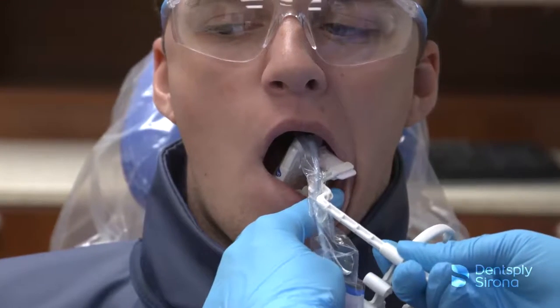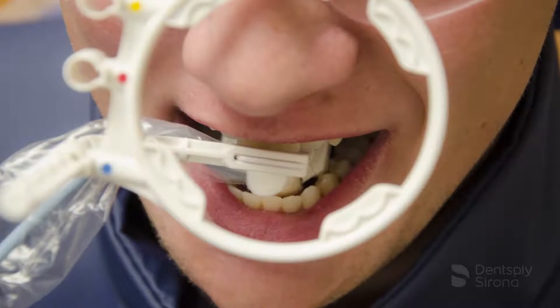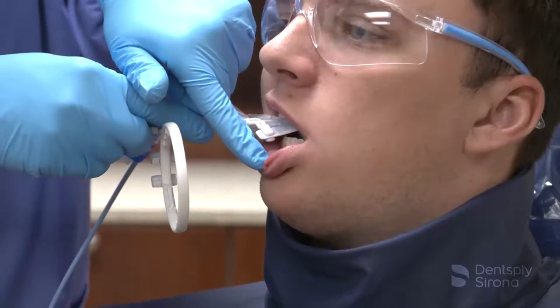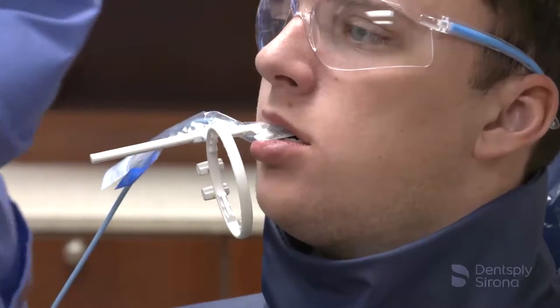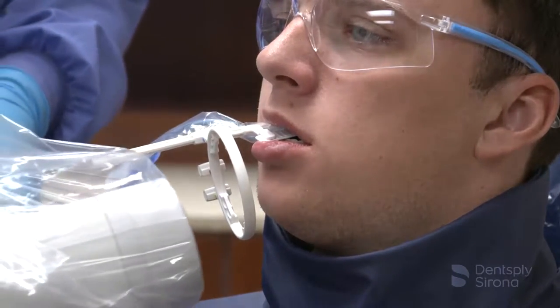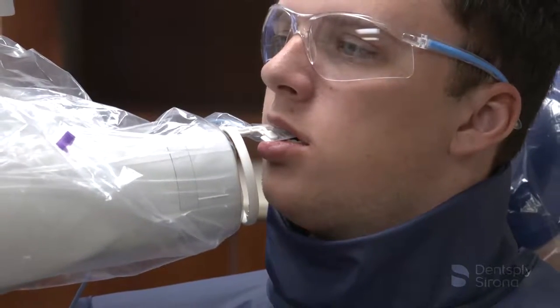For use with a shallow palate, place a cotton roll under the bite piece to aid in patient comfort. Once the bite block is in place, slide the aiming ring down the arm close to the patient's face. Align the tube head of the x-ray unit in a close approximation to the aiming ring and center it. The x-ray image is now ready to be captured.